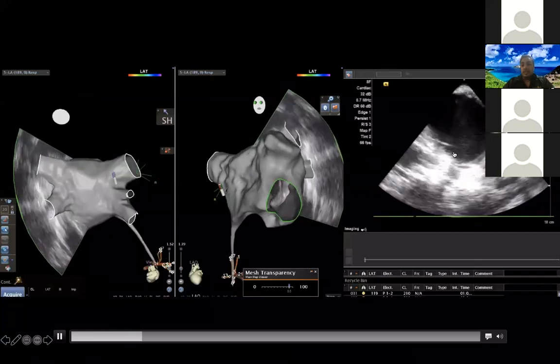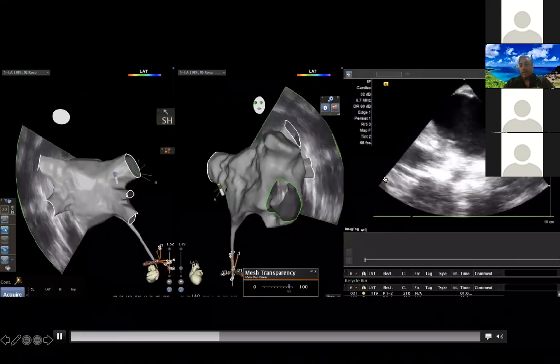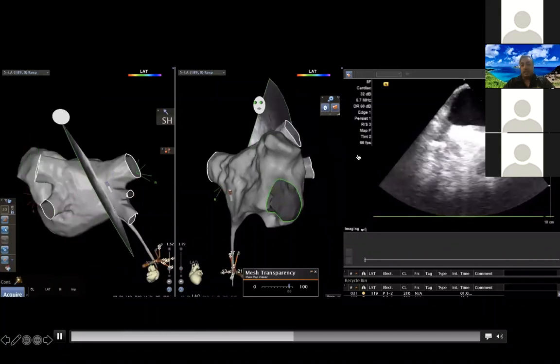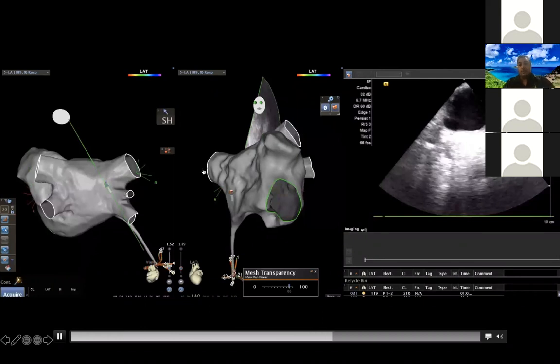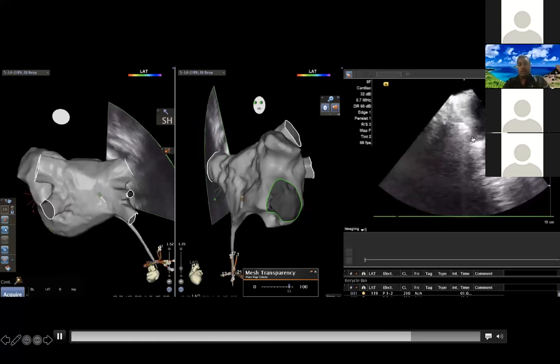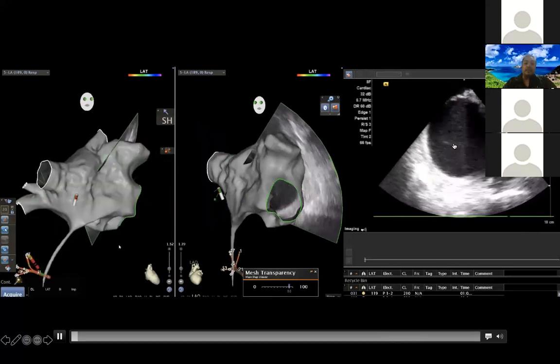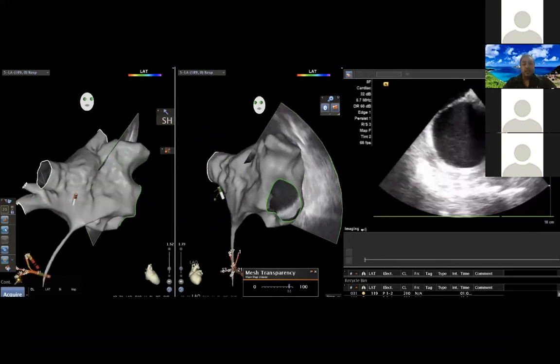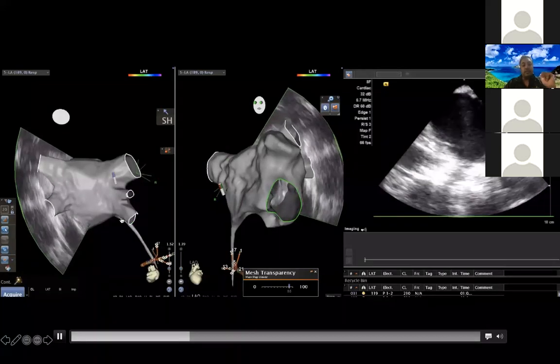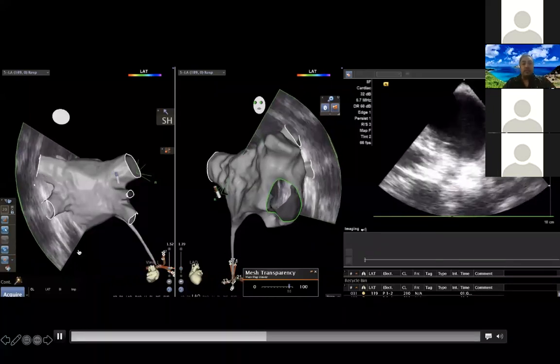Here you can see I'm clocking the catheter. You'll see me cutting through the veins here. This is the left-sided veins. If you look on the right, you can see the carina in the middle and the two veins. And as I clock, you can see how you're sweeping through the posterior wall. That was the right lower pulmonary vein there. And if you keep clocking, you'll usually bring in the right upper pulmonary vein. So everybody's anatomy is a little bit different, sometimes maddeningly different. But for the most part, if you sweep through this sequence, you should be able to predictably see structures that you would be expected to see.